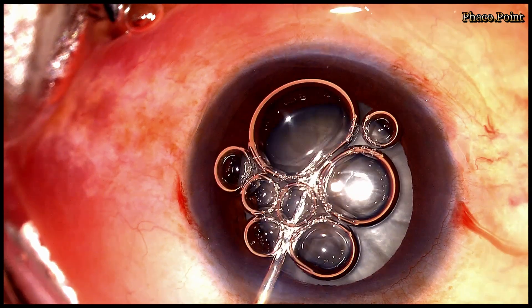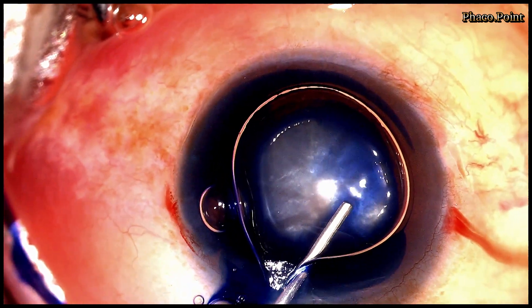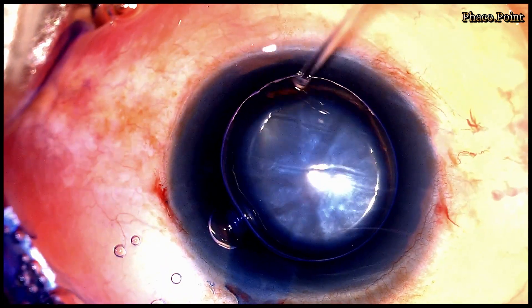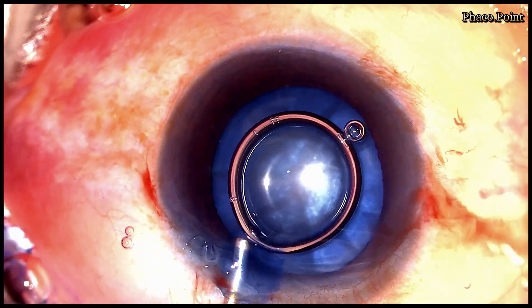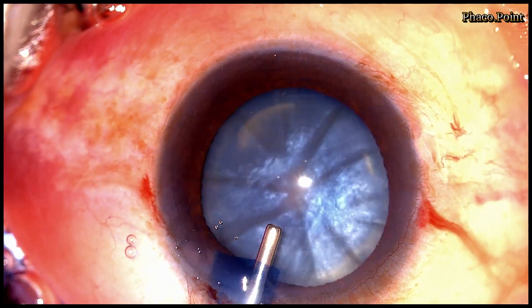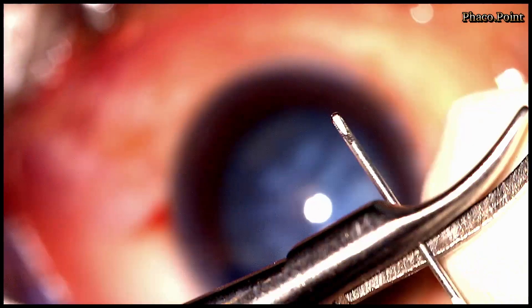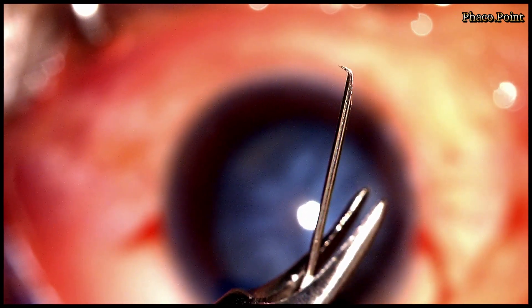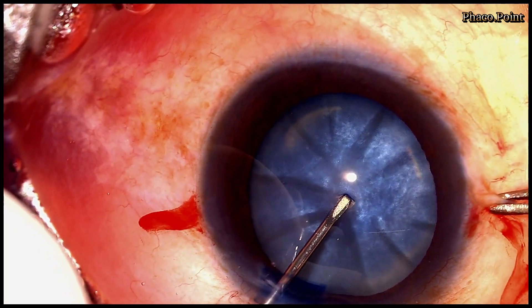In this manner, we are able to inject the air into the anterior chamber first, under which we drop in the blue dye so it spreads over and optimally stains the anterior capsule. A cohesive or dispersive viscoelastic is always used to flatten the anterior capsule to aid in the capsulorhexis. Another important consideration is the optimal creation of a perfect cystitome — I prefer it done under the microscope and always check the tip to ascertain there has been no damage whilst making it.